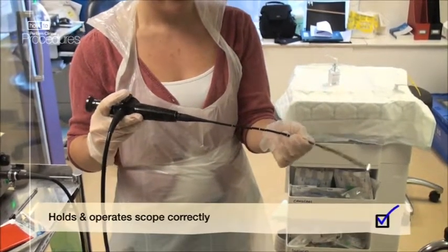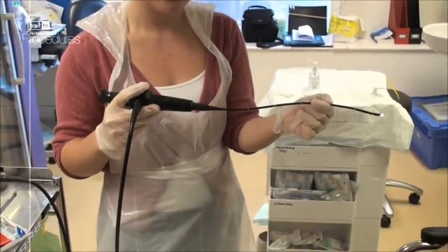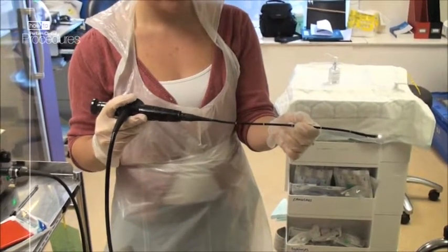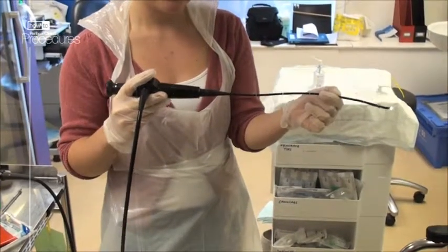Hold the eyepiece and controls in your dominant hand and the remainder of the scope in your non-dominant hand. Your index finger can be used to move the scope tip up or down. By rotating the scope and moving the tip up or down, you can direct the scope in any direction.